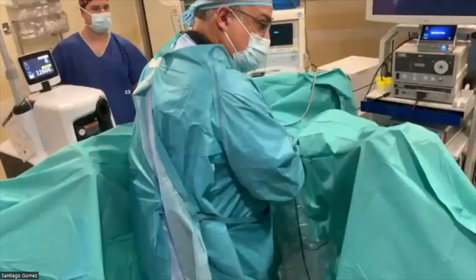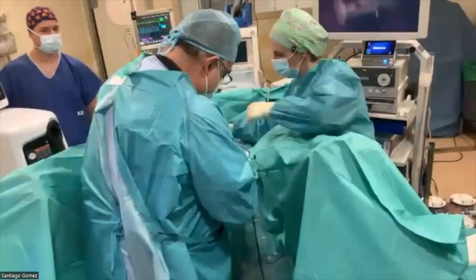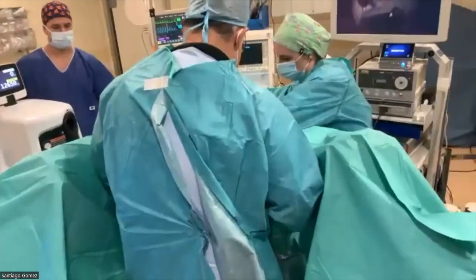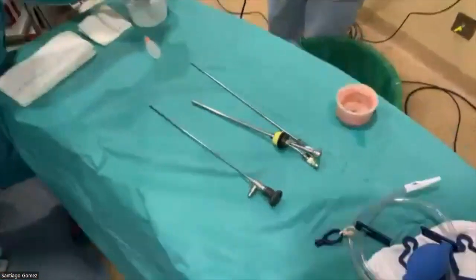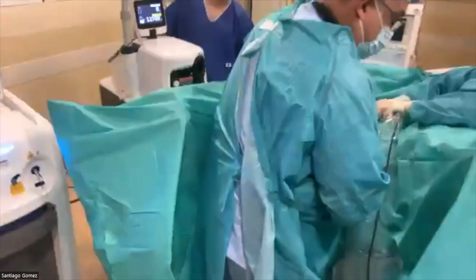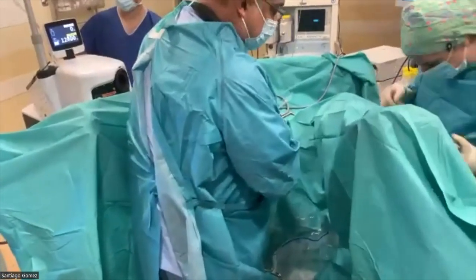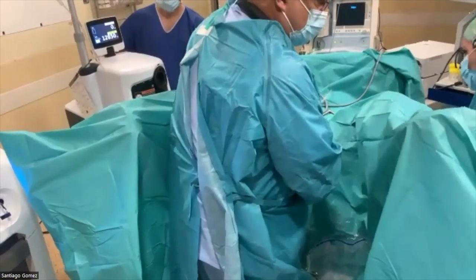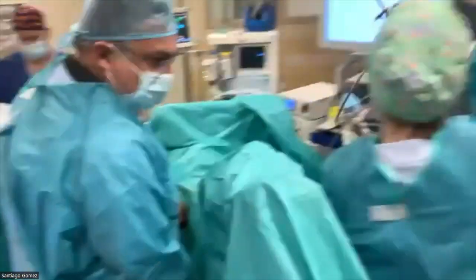In simulators or models. Yeah. I think it's a good idea before you start your initial case. I think simulators can give you some clues about how to fold the scope. And also they give an opportunity for the teacher to explain how to handle the fiber, how to handle the scope and everything. But I don't think that when you have done some cases, continuing to use the simulator will help you further. You know what I mean?